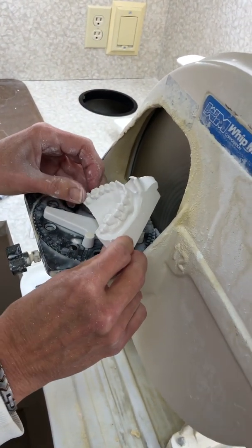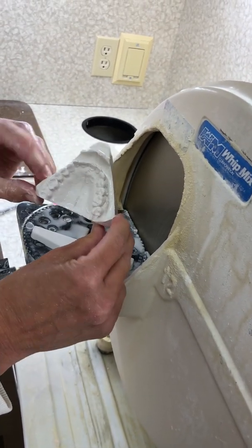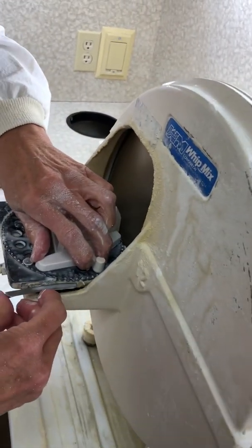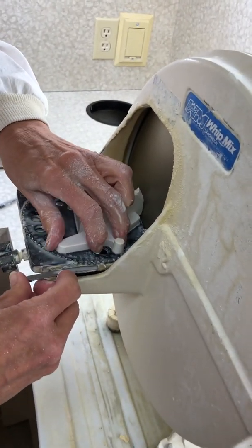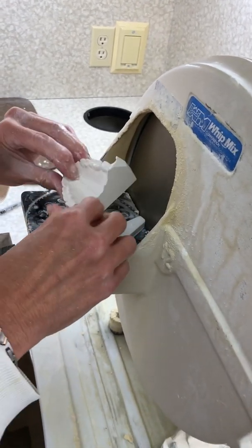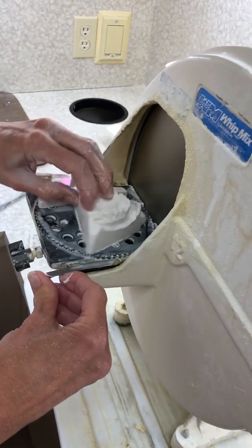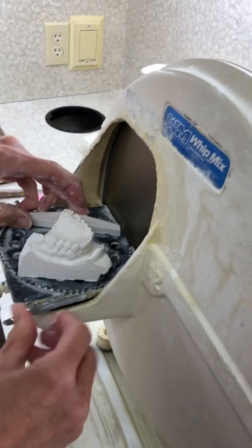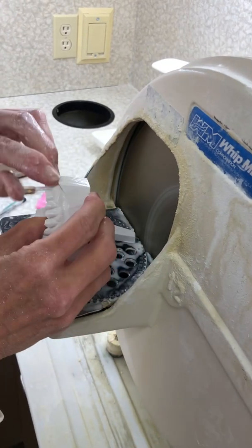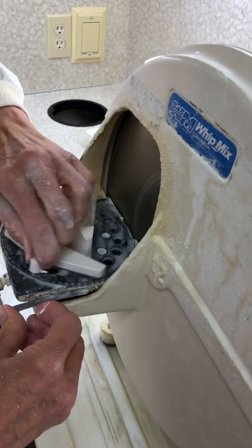So again, look straight on. It looks pretty good now. See that there? And then what I want to do is I want to do my 115s and save the front for the last. Good. And again, just kind of watch your heels. I think I might do the other one first, just because of the way it's sitting. Again, watch your molars. Make sure that they're not going to be chewed off.